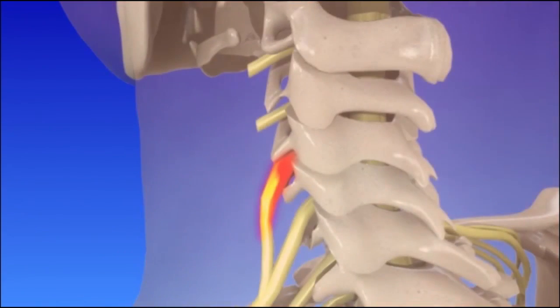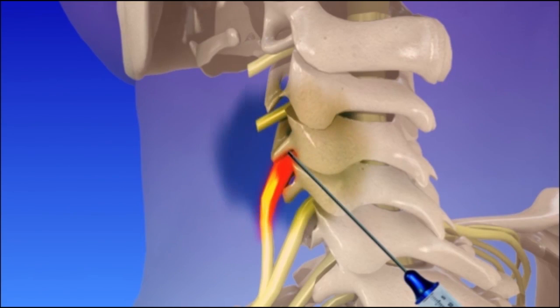Your doctor will use a live x-ray to carefully insert and guide the needle to the foramen tunnel of the affected nerve. A contrast dye is used to confirm the needle placement.